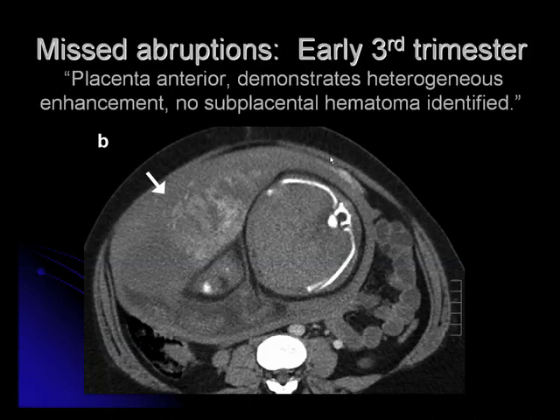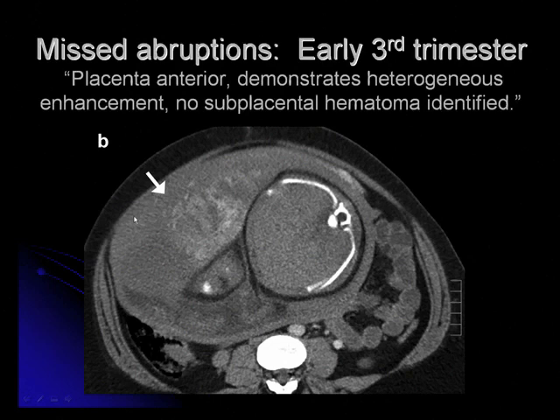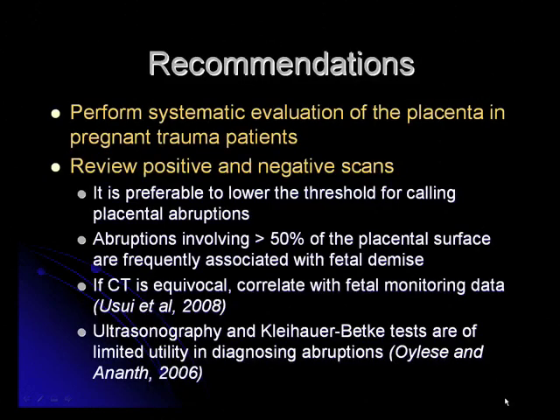This is another example of a missed abruption due to a large retroplacental hematoma occurring in the early third trimester. The original dictated report stated that the placenta demonstrates heterogeneous enhancement and that there was no subplacental hematoma identified. When in fact, if you look carefully, you can see an undermining of the placenta by a large space-occupying density similar to the density of the myometrium. Our data suggests that a systematic evaluation of the placenta in all pregnant trauma patients would be beneficial in improving sensitivity of detection. We encourage continued review of scans positive for placental abruption and normal scans showing normal placental anatomy. It is preferable to lower the threshold for calling placental abruptions, as any abruption involving more than 50% of the placental surface has been frequently associated with fetal demise.